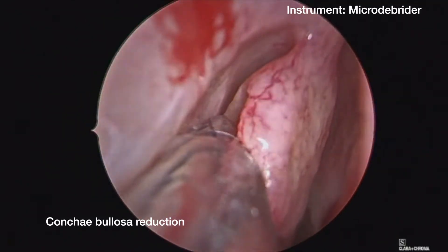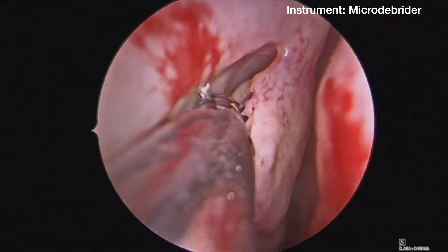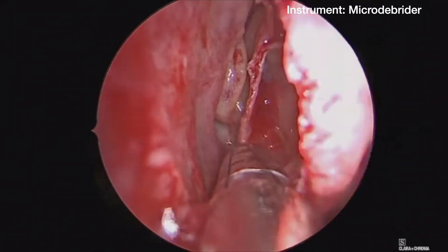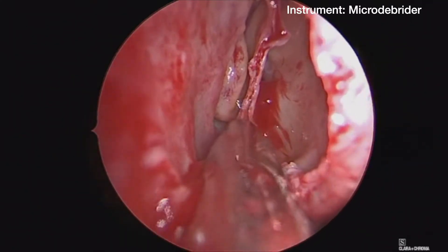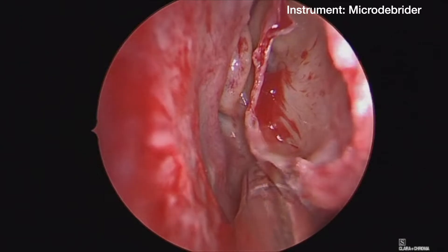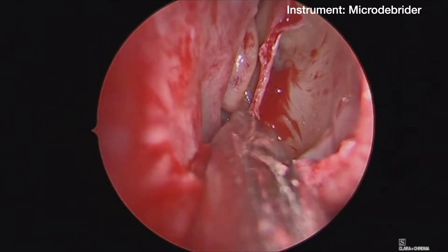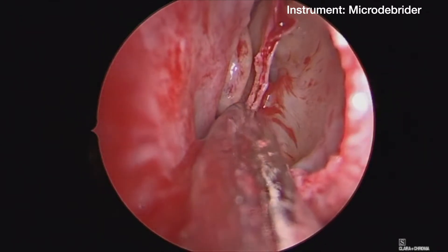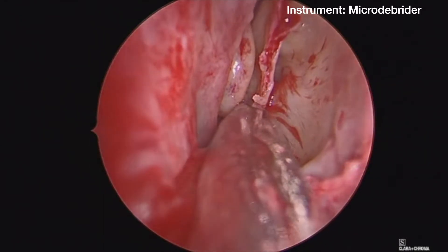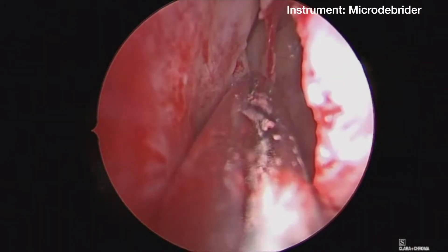We elected to reduce the patient's concha bullosa for exposure and working room. This is done with the microdebrider. Posteriorly, you can see the natural os of the concha bullosa cell, similar to any ethmoid cell.